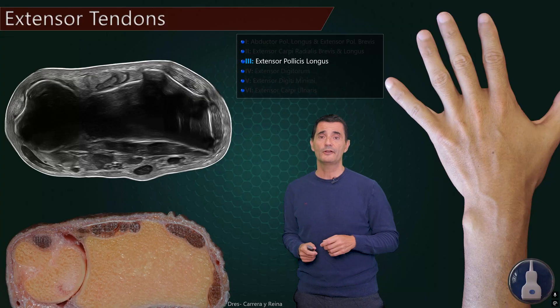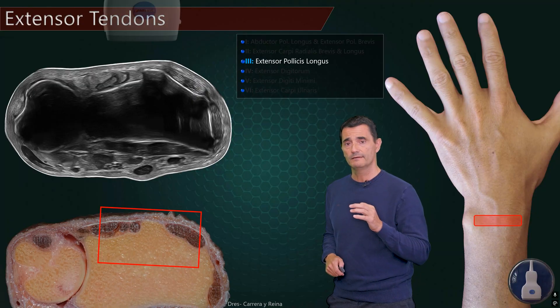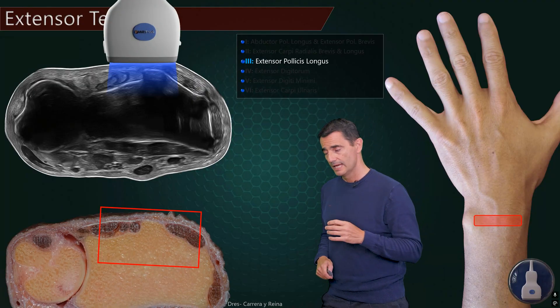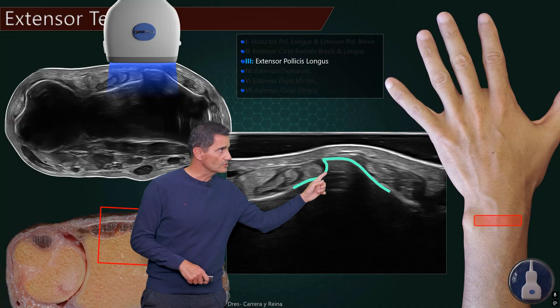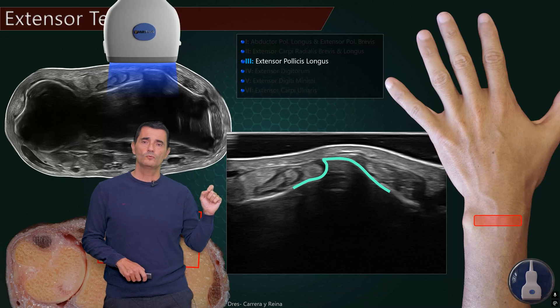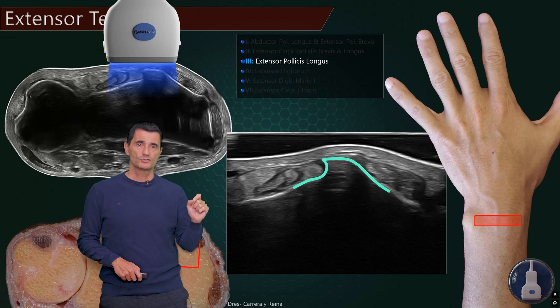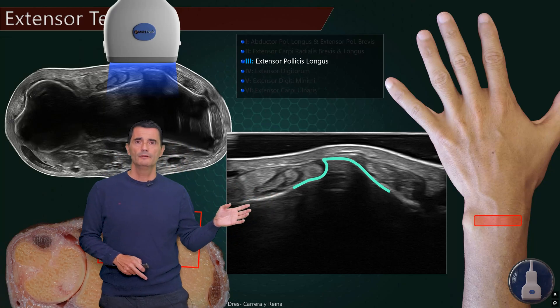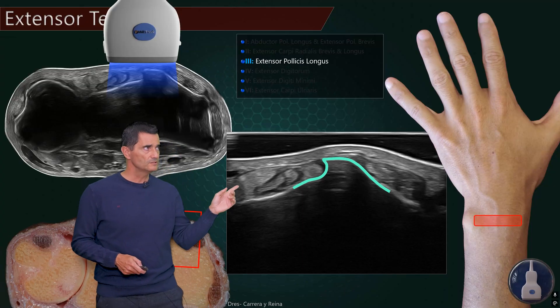This is a reconstruction with ultrasound. The first structure we are going to search will be located just right there, and we will obtain this image. It is very important to locate this bony structure — very characteristic — that will be the Lister's tubercle. The Lister's tubercle will be the first and most important landmark on the dorsal side of the wrist. Usually it has this wavy shape, but sometimes it's more rounded, or sometimes it has a double horn — it's quite frequent to find different shapes.